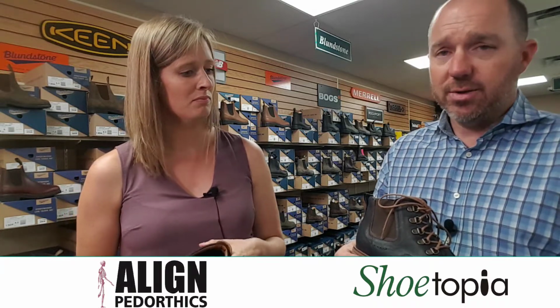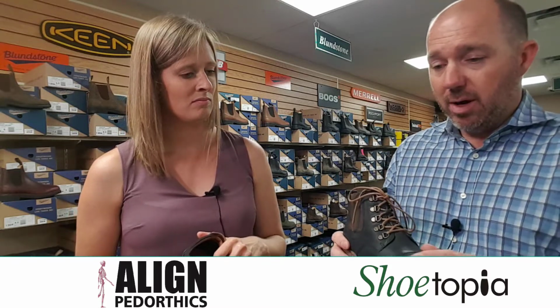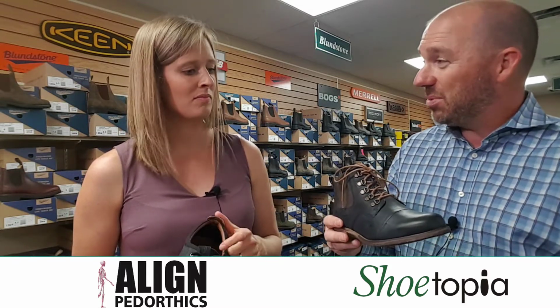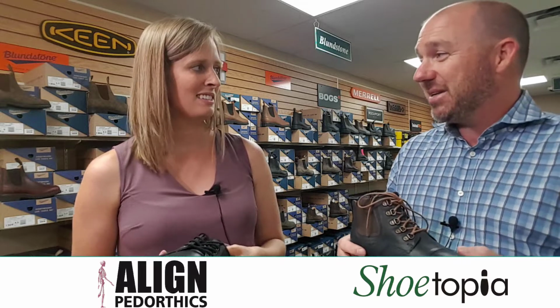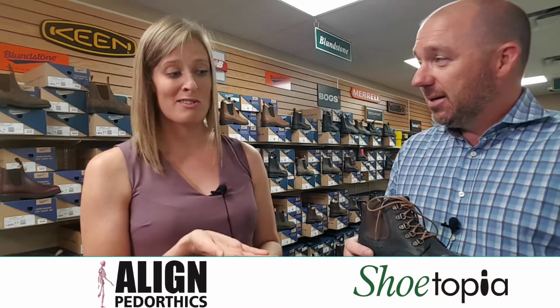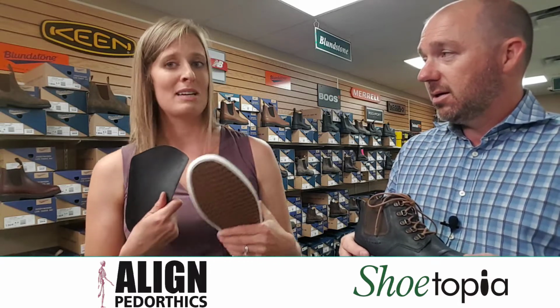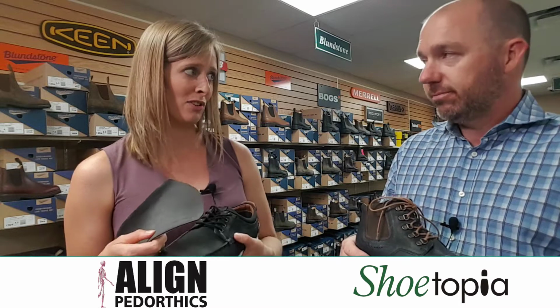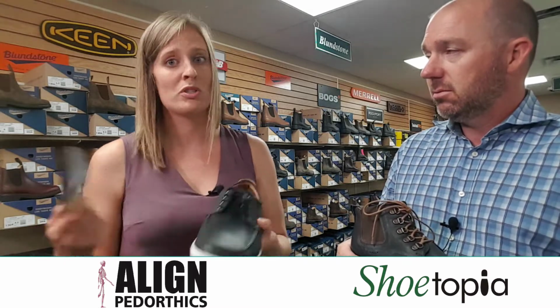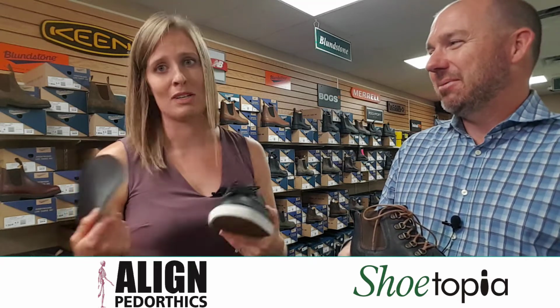Yeah, we've seen that for sure too, and sometimes even on the fit of the front of a full piece, they might need to trim it down to fit the given sandal or whatever the case is. And the other thing too is if you have a 3/4 length orthotic, you can always get that made into a full-length orthotic and vice versa. Yeah, that's good to know. If you have more dress shoes than running shoes, then you might need to just get that trimmed down, or the vice versa.